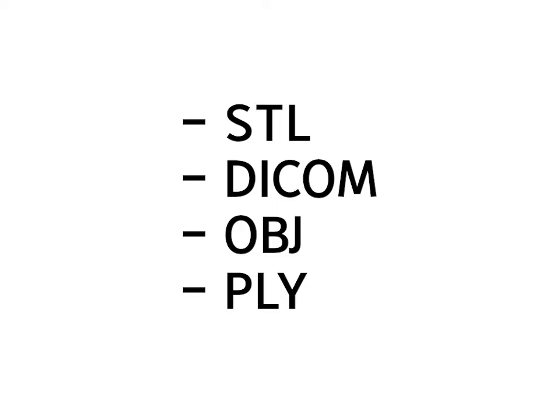It is very important to mention that all of the aforementioned files can be encrypted as closed. This is often done by manufacturers in order to force the technician or the dentist to remain within the specific workflow in which all devices and software are supplied by the same company, including scanner, design software, and production unit.